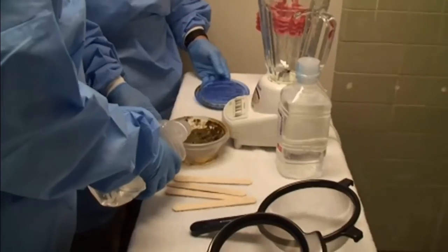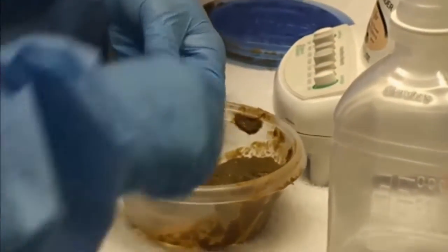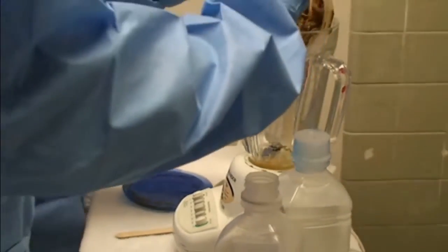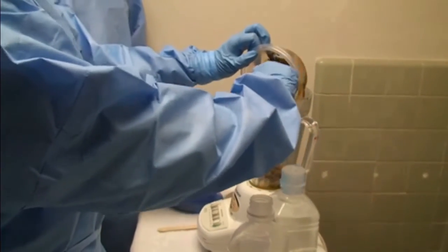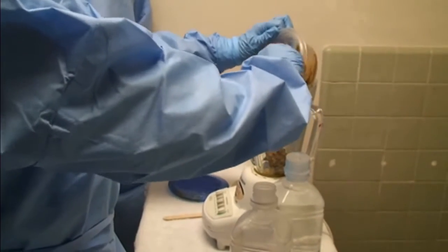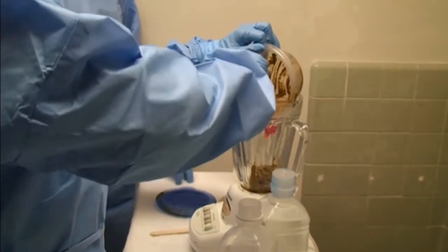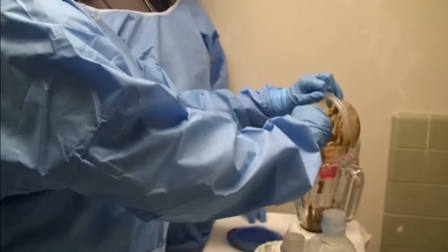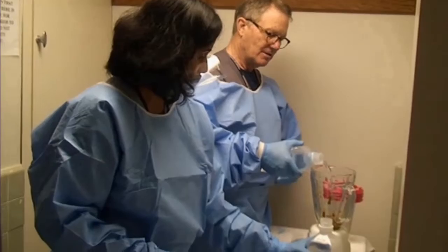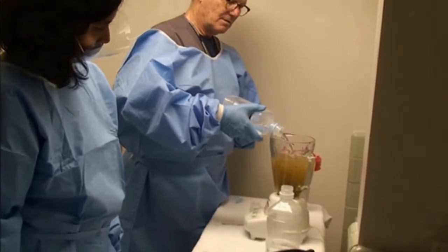We are opening the donor stool container. Between 50 and 60 grams of stool have been recommended to be mixed with 300 cc's of normal saline. In our institution, we traditionally use larger amounts than this. In this case, we are mixing the stool with a liter of normal saline, because we plan to divide this donor specimen into three different fecal transplants on this particular day.